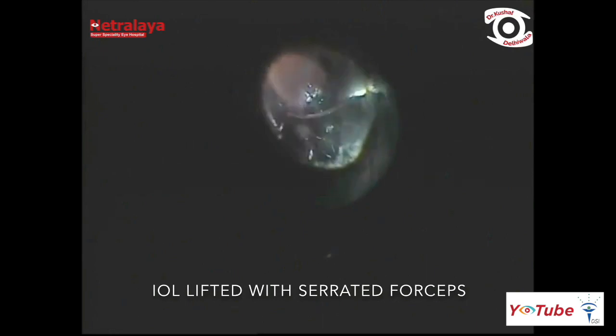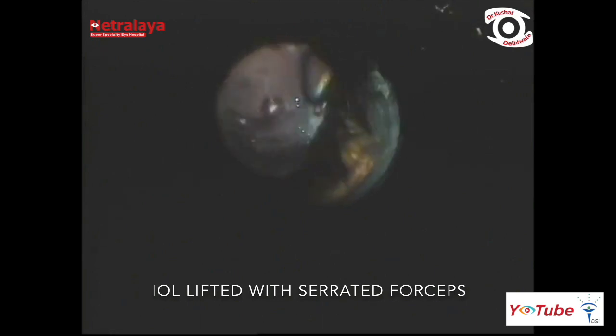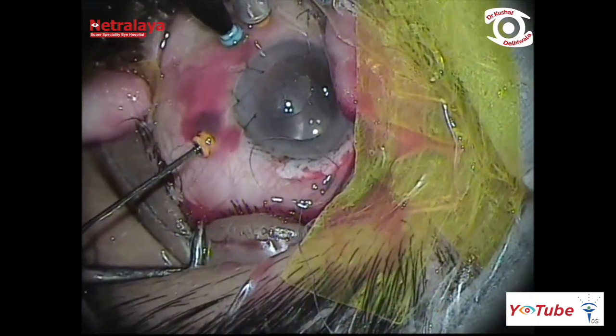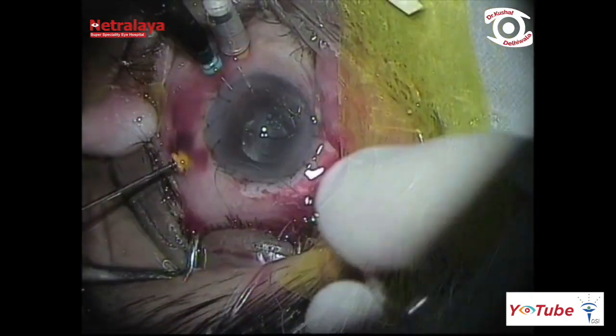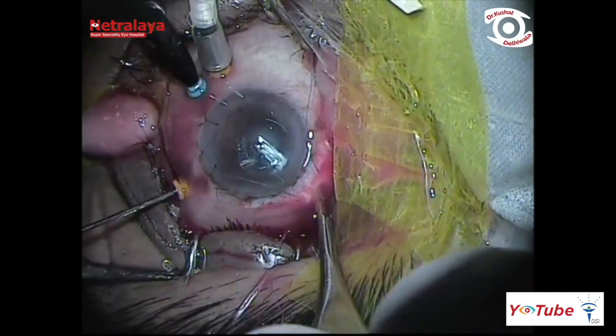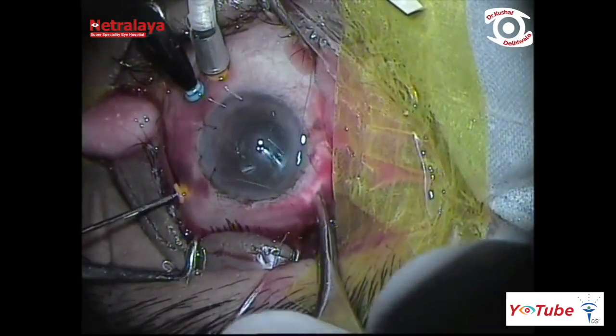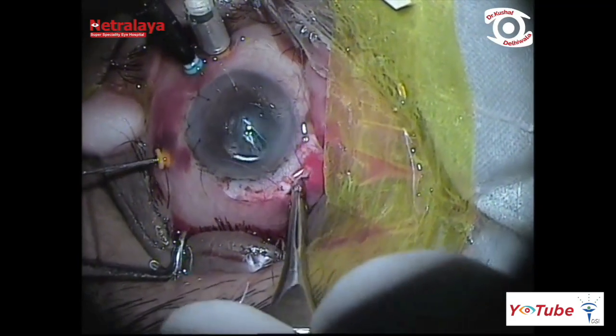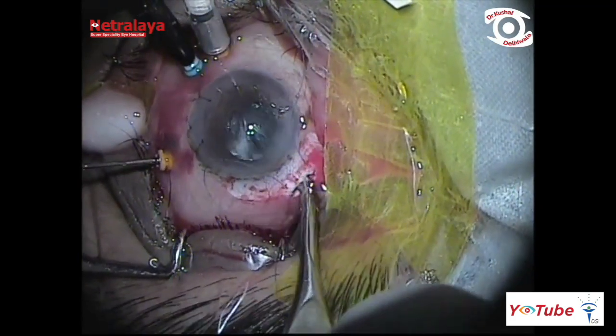The dislocated IOL was lifted with serrated maxgrip forceps, and subsequently a one-angled capsulotomy scissor was introduced supranasally to cut the IOL optic intravitreally into halves. One can also use specially designed IOL cutters or scissors.